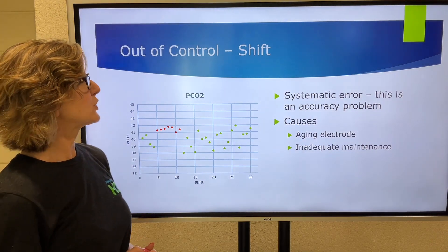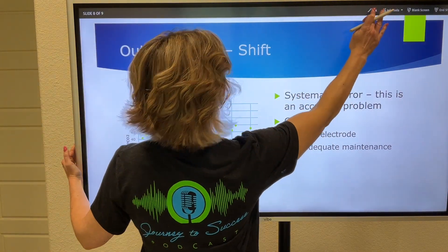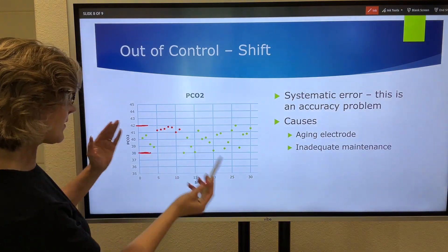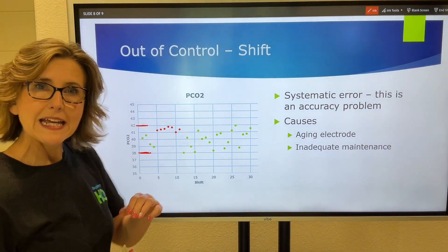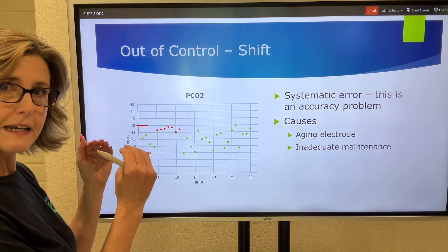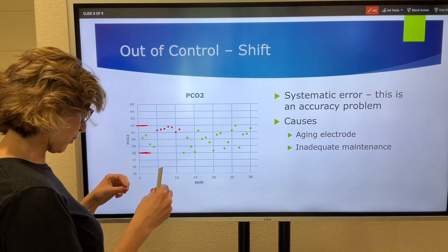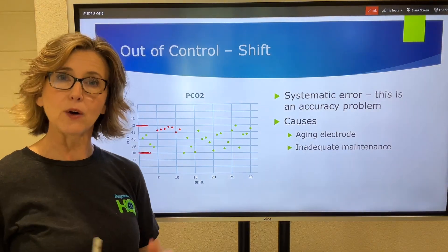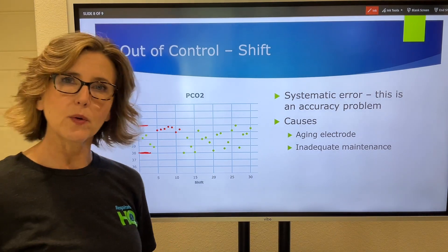Here is another out-of-control situation called a shift. We still have our two standard deviations — 42 above and 38 below. Everything in green is within that range. But if you see five, six, or seven consecutive dots all on one side of the mean, that is a shift — a shift in the mean value above or below where it normally is. That is an out-of-control situation, caused by aging electrodes or inadequate maintenance to the blood gas machine.